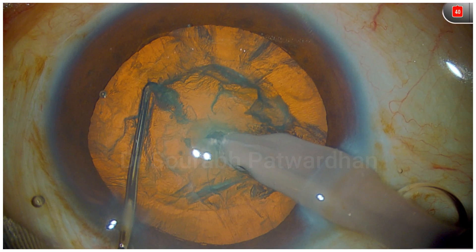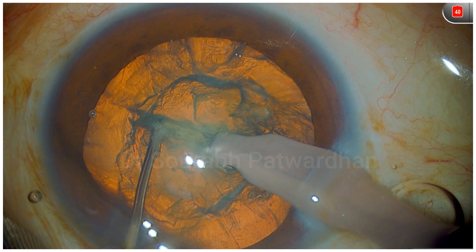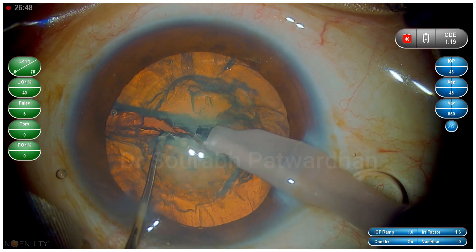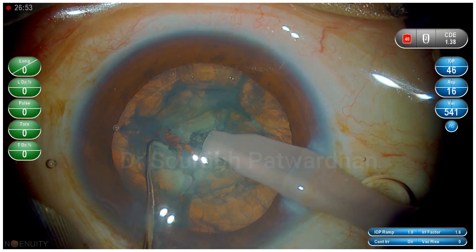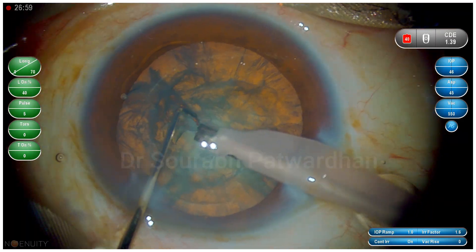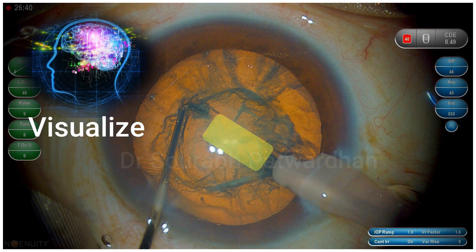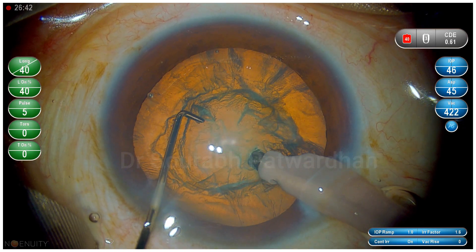Watch that tip going deeper into the nucleus and very carefully judge the right depth. It has to reach the posterior half of the nucleus — approximately at the mid of the nucleus — before you start attempting the chop. Unless you reach that particular spot, you should not try attempting primary chop.